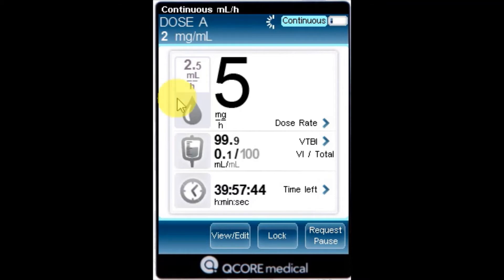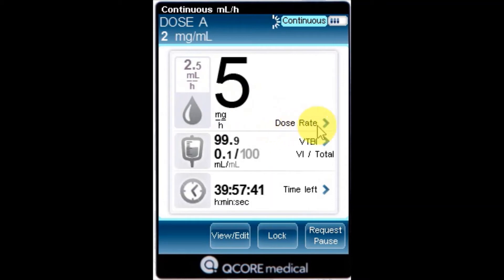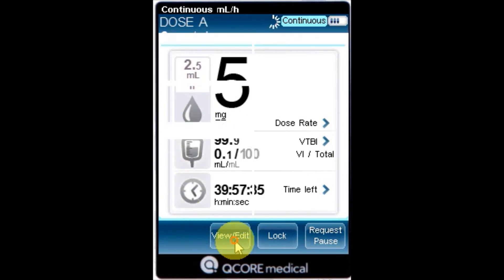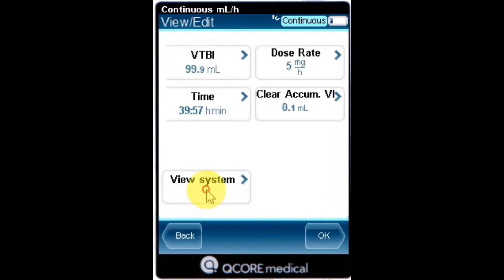Rate: the current infusion rate. For all dose units other than mLs per hour, the calculated rate will be displayed in mLs per hour, both in the view system menu and in the running screen.